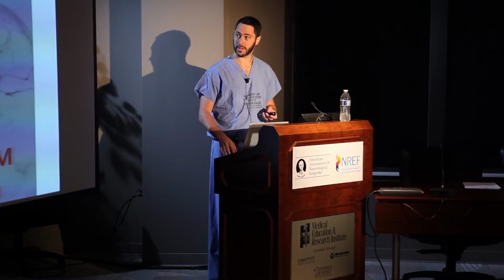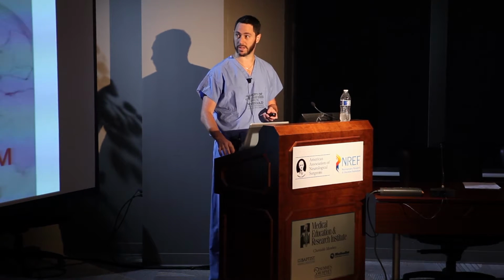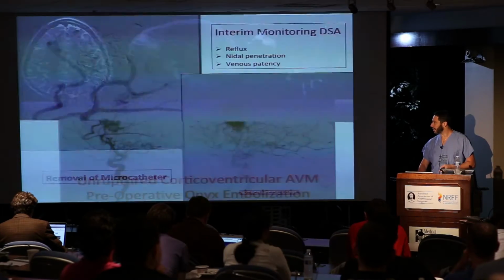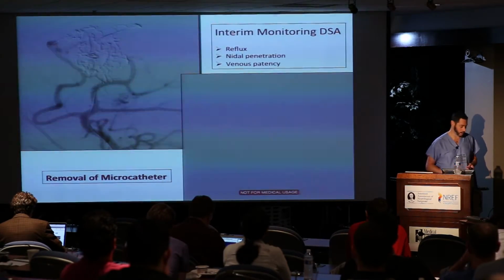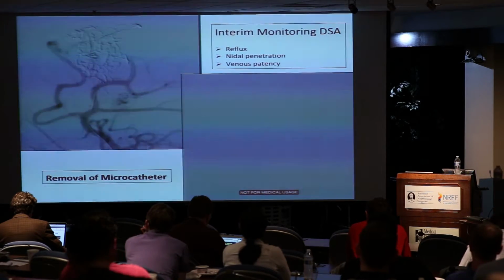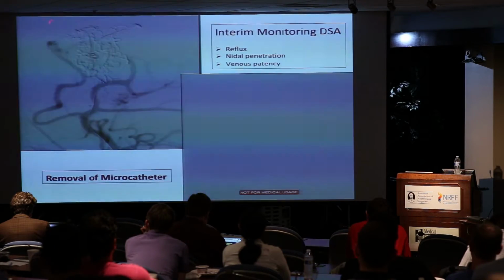If I'm going to help the surgeon who's asking you to do this embolization, I want to take out particularly the deepest stuff next to the ventricle where he's going to have to reach down. Okay, and I'd like a decent volume embolization. Okay, he's looking to have a dry operation. Okay, so you can see the Onyx cast.